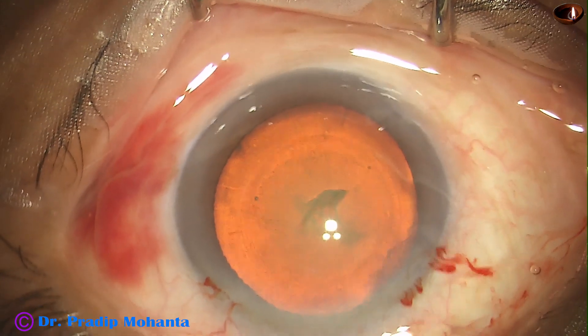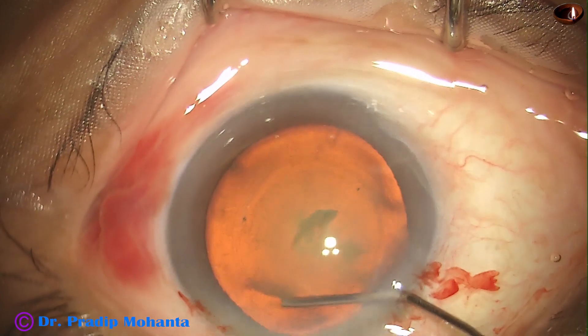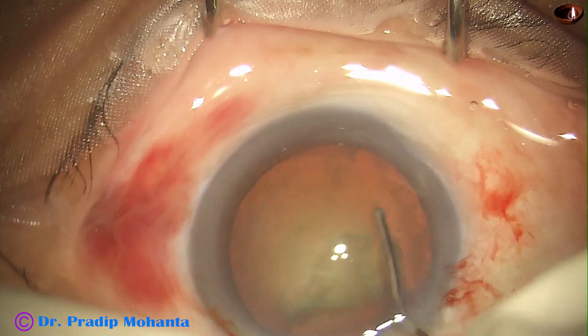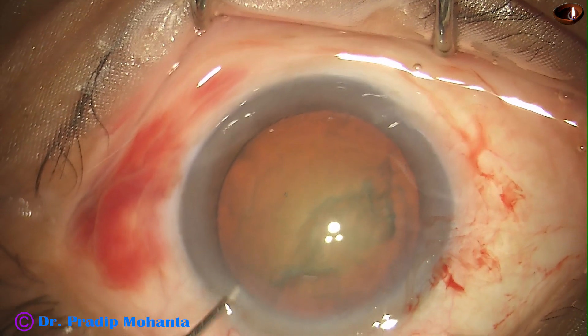Capsulorrhexis is done. Now, hydrodissection. BSS is passed, and as the fluid wave goes to the opposite equator, the red glow decreases. This is normal.